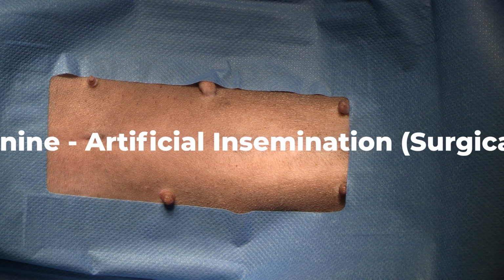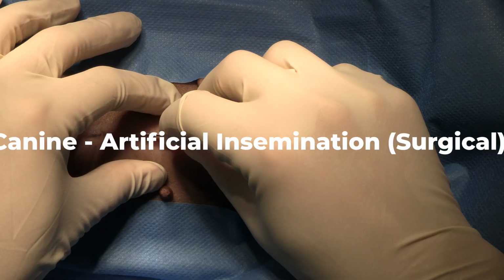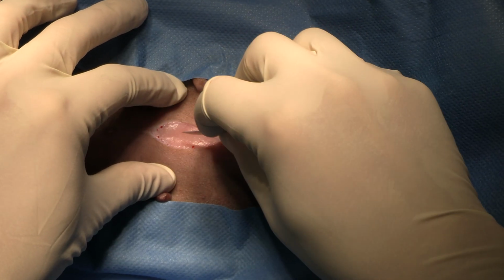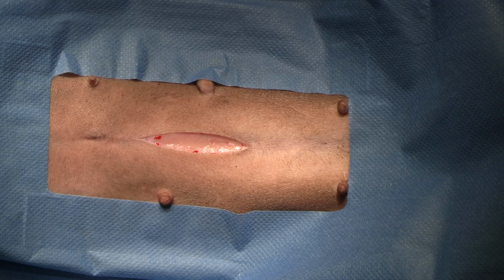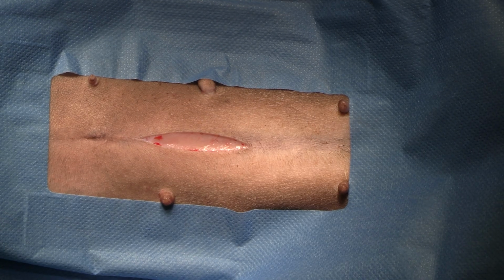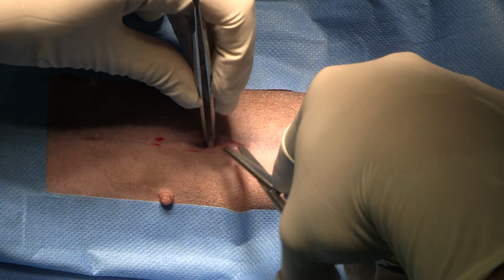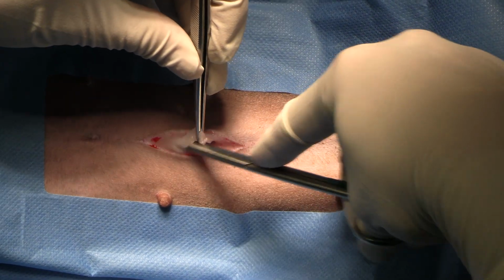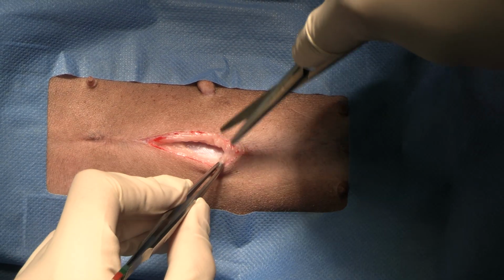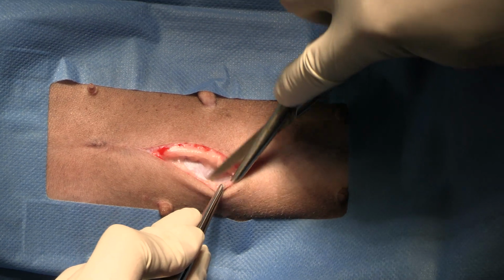Alright, so this is a surgical insemination. Umbilicus, pubis, thirds. We're going to be going, as always, caudal part of the cranial third and cranial part of the middle third. Through the skin. Delicately through the subcut tissue. Exposing that linea alba.